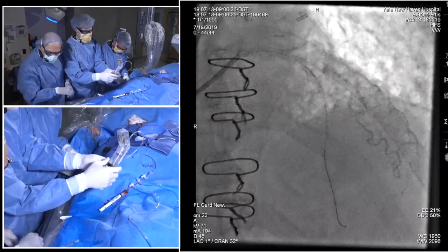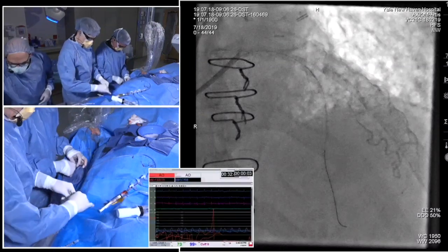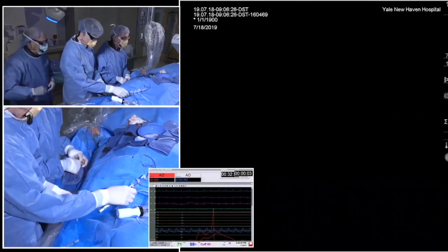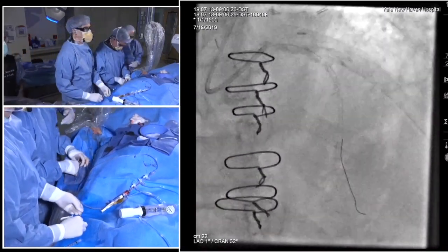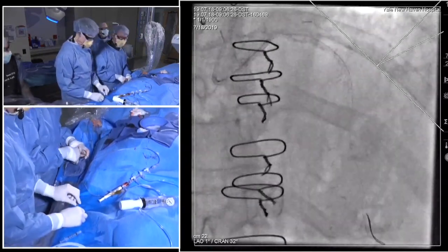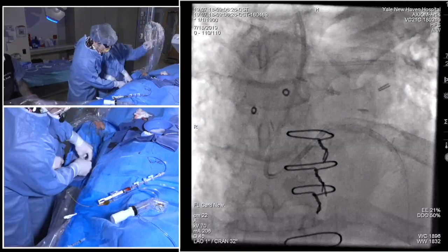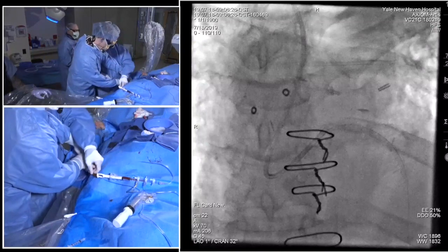So flow looks better, and the patient's hemodynamics are stable? We're using a little pressors, but I think we're going to be fine here. Yeah. Step on flow. Now, there are other techniques that you could use. You can keep the rotawire down, and you can wire with a second wire, and then do your balloon inflations. If it doesn't expand, then you can roto more. But in this particular case, with slow flow, the likelihood that anybody's going to be enthusiastic about doing any other rotoablation is going to be low. So at this point, swapping the wire with a microcatheter is a good approach.